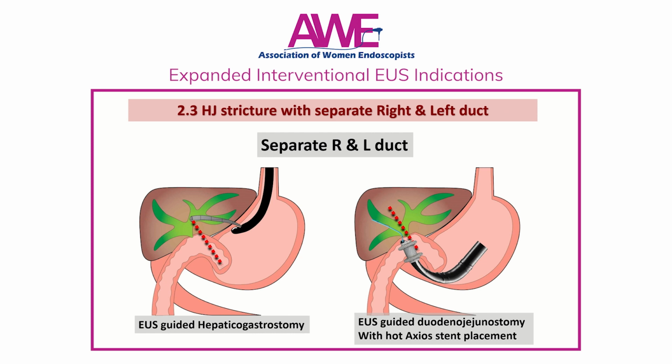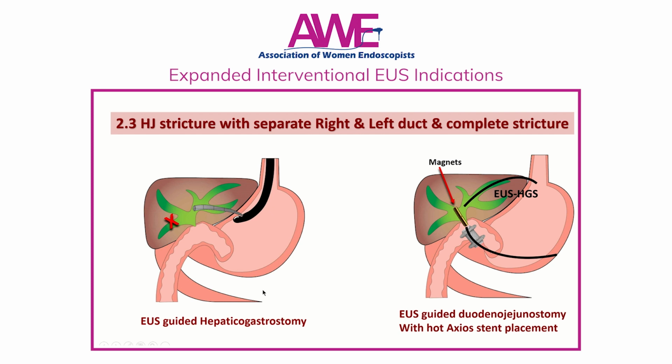With the same concept, the EUS-guided procedure can be used for treatment of separate right and left ducts in patients post hepaticojejunostomy Roux-en-Y.